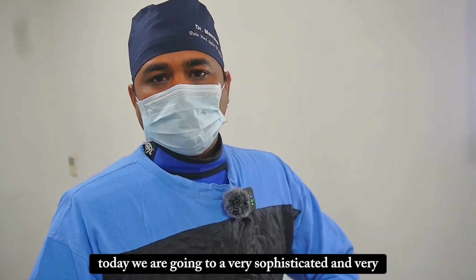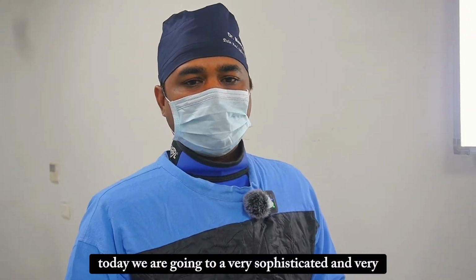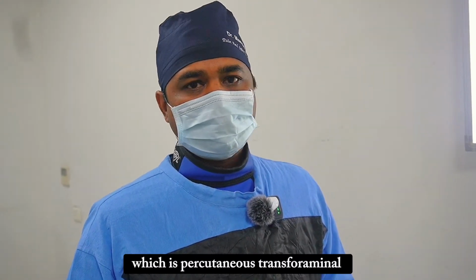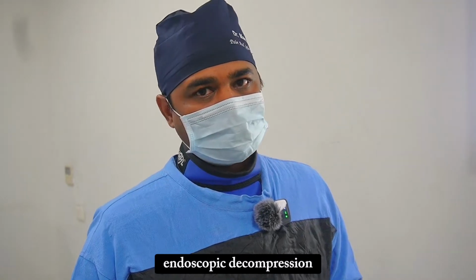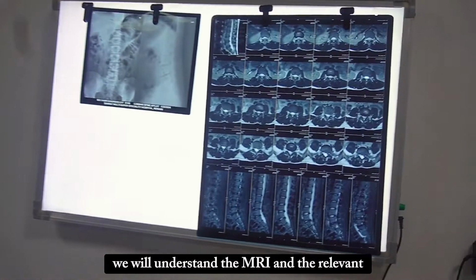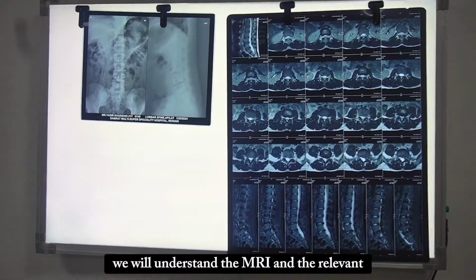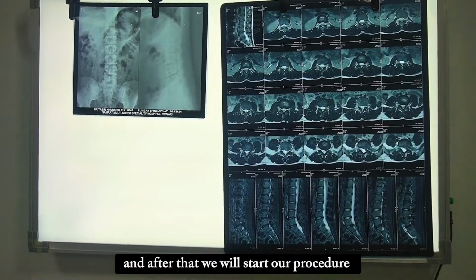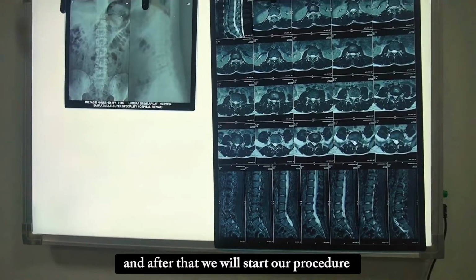Today we are going to do a very sophisticated and very simple procedure for disc prolapse, which is percutaneous transforaminal endoscopic decompression. First of all, we will understand the MRI, the relevant clinical features and the history of the patient, and after that we will start our procedure.